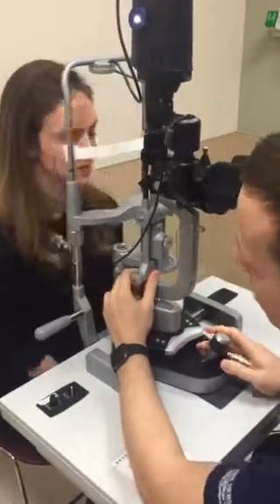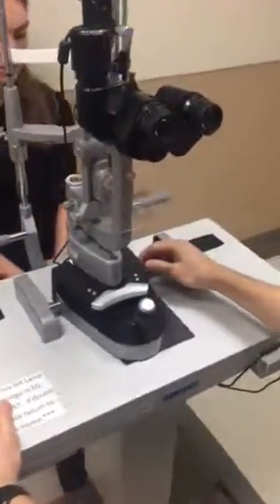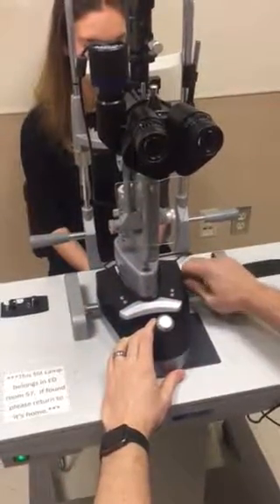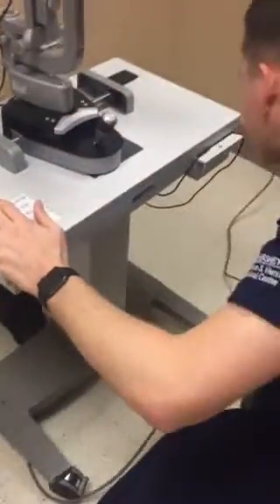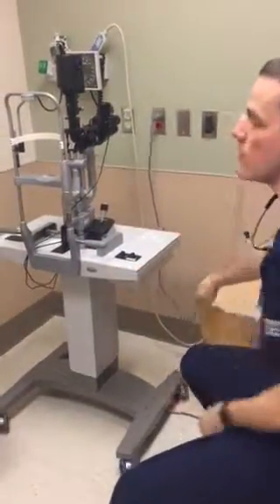When you're done, lock the locking screw — this is an expensive piece of equipment and if it's free-floating on the table it can get damaged. Lock it, then pull the slit lamp away by unlocking the wheels, put it to the side, and turn it off. The slit lamp exam is obviously very technical and it takes a lot of practice to get proficient at it. But if you do a slit lamp exam for every eye patient you have, with time you'll get better and do your patient a lot of favors by performing a more thorough exam.